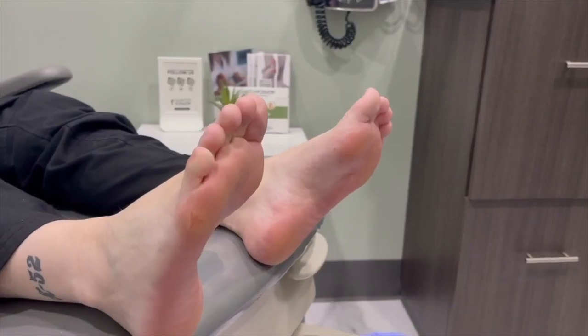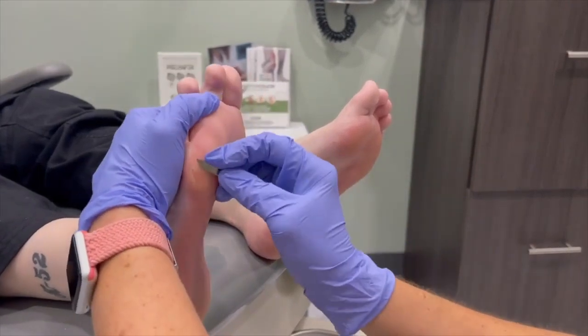She has a really bad high arched foot and needs an orthotic. This young lady has some calluses on her feet. It just goes to show you, you don't have to be a little old lady or man to get calluses. A lot of times people stand on their feet all day and the constant pressure, especially on hard surfaces, causes calluses from pressure points. And orthotics can help to correct that, but sometimes it doesn't make it all go away. So let's try to trim them.